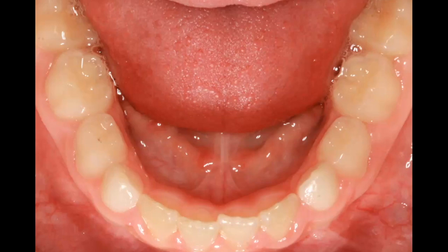Haven't I showed you a center occlusal yet? Or a center photo, intraoral? Okay, you're seeing kind of the stretch there? Yeah, so she may be a little bit tongue-tied. Honestly, I'd have to go back and look. But we talked about the midline being off, right? So let's have a vote. I don't think I've showed you a center intraoral yet, right? Okay. So is there a unilateral crossbite or is there not a unilateral crossbite?